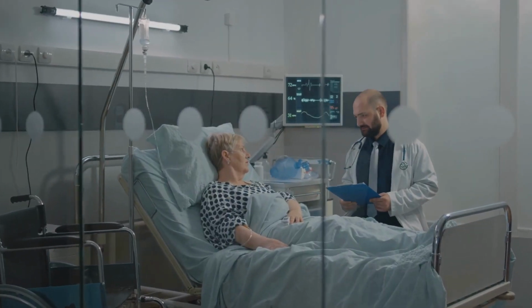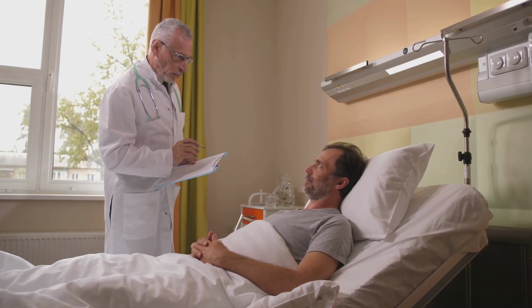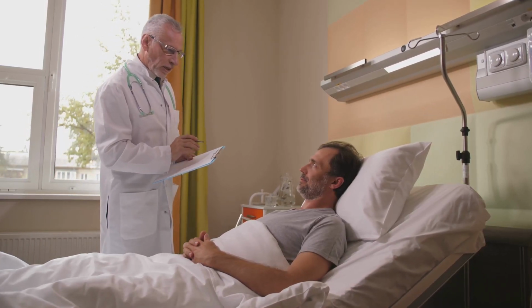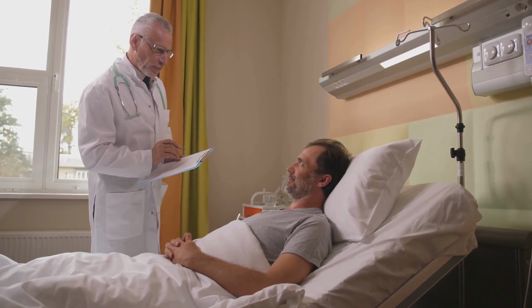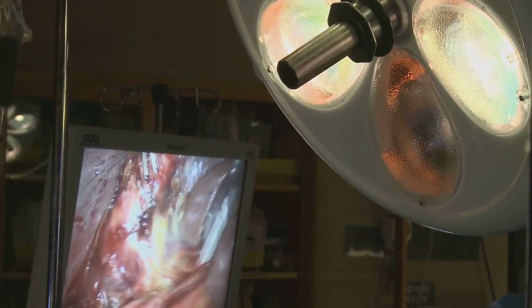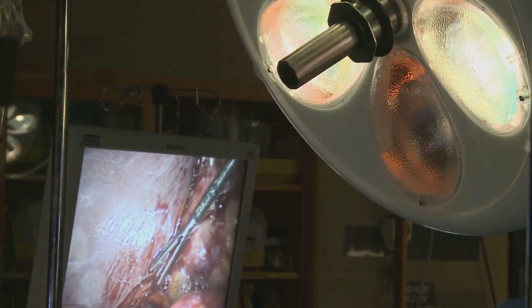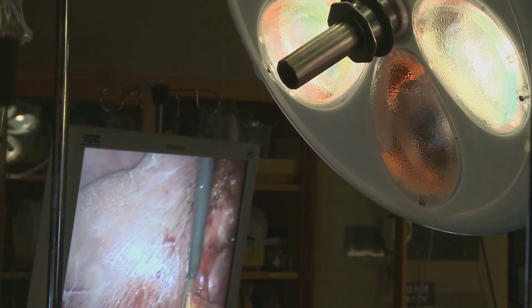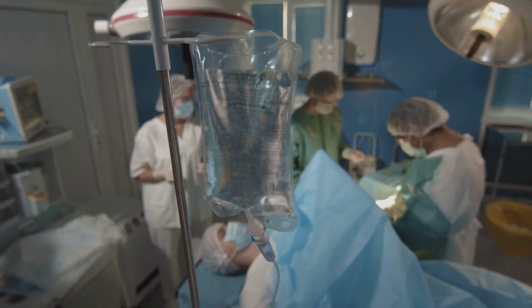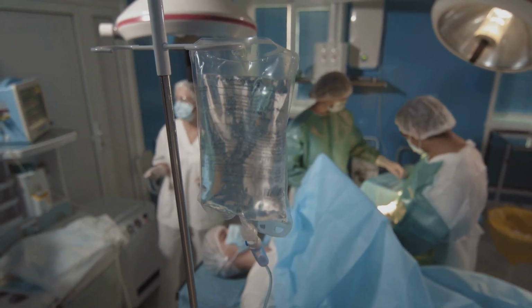We've also seen that the success of awake intubation isn't merely about the technical aspects. Psychological buy-in from the patient plays a significant role. Building trust, explaining the procedure, and addressing any concerns can go a long way in ensuring a smoother process. The actual procedure of awake intubation involves several steps, each with its own intricacies. We start with the administration of an anti-sialagogue to reduce salivation and make the process easier.